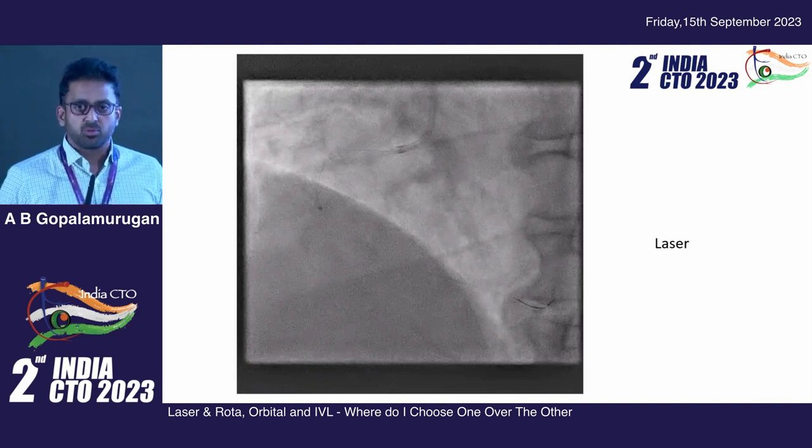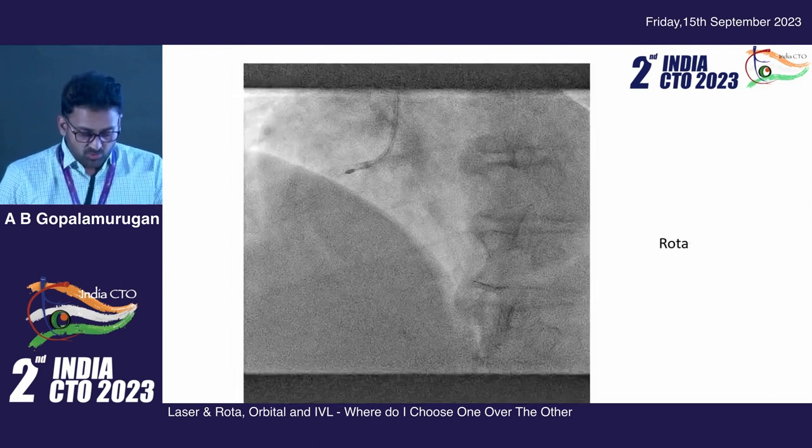Traditionally, perhaps we'd have put some balloons, we'd have done some grenadoplasty, rupture a few balloons, dissect it nicely, but you cannot carry on with the angioplasty. You probably want to bring them back on another day. But laser allows creating a channel or perhaps modifying the lesion to allow a microcatheter. And that's what we managed to achieve.